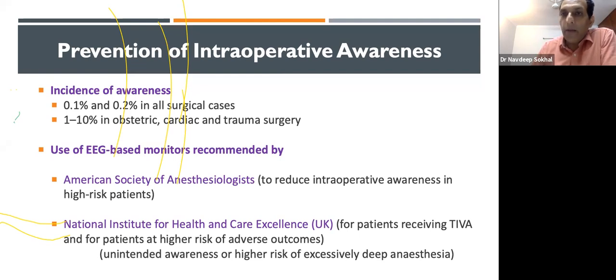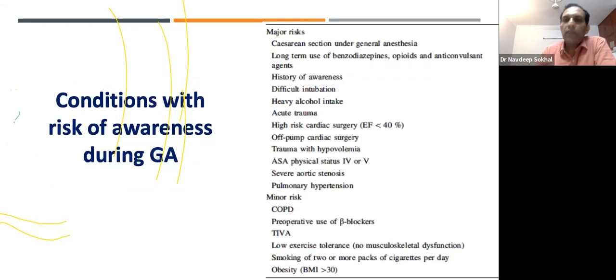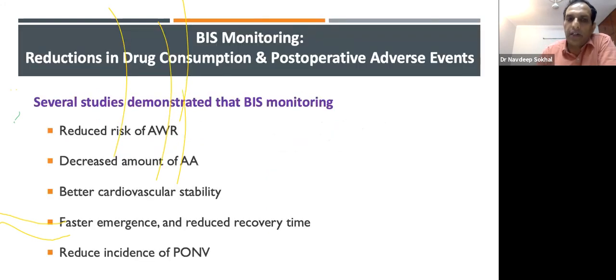Now, remember, I'm saying it has been recommended for use in high risk patients. That means they have not recommended it for routine use, but they have for high risk patients. We will see why not in routine use. These are the surgeries and conditions with high risk of awareness.